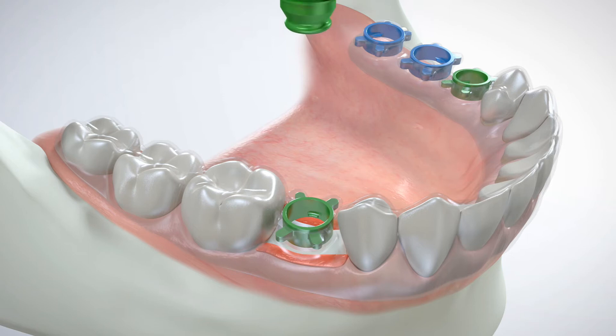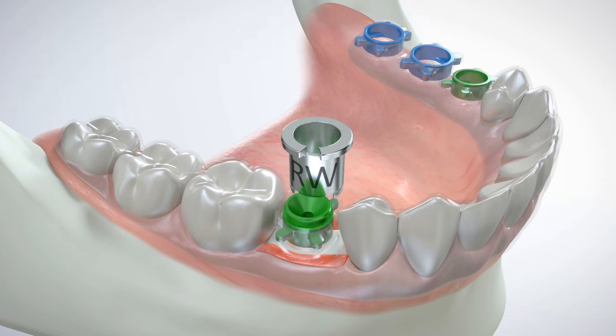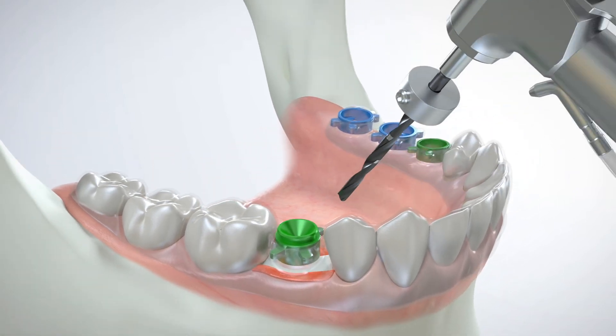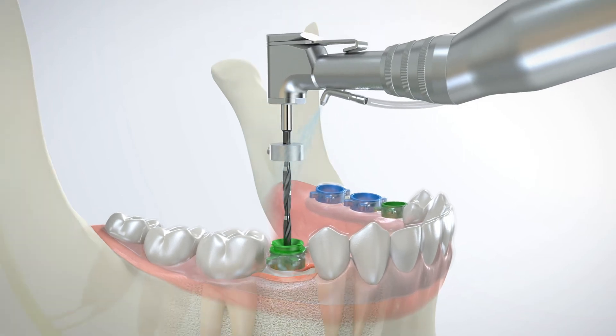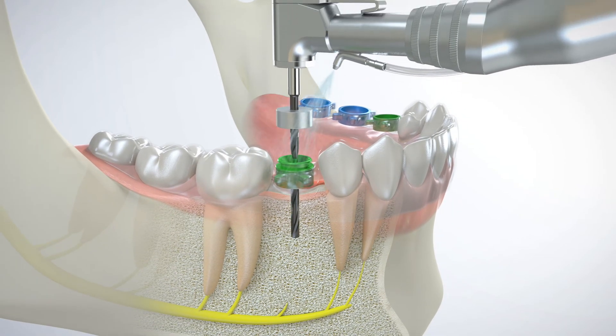The drill sleeve is then snapped into the surgical guide and the IR tool simply separates from the drill sleeve using a sliding motion. The internal diameter of the GRS surgical drill sleeves precisely matches the corresponding surgical drill in a planned surgical sequence. A surgical drill fitted with a preset GRS drill stop is precisely guided by the GRS surgical drill sleeve at the planned angle and orientation.